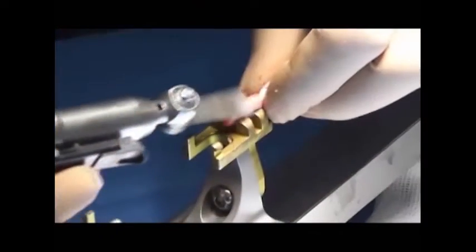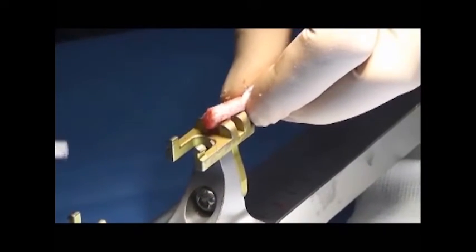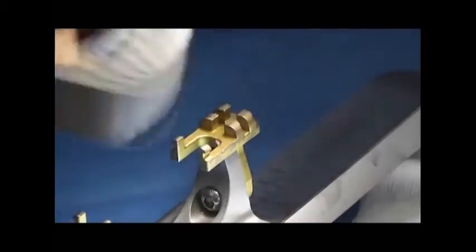Harvest the bone tendon bone graft, clean it, and size it down to match the diameter of the tunnels to ease its passage through the tunnels.